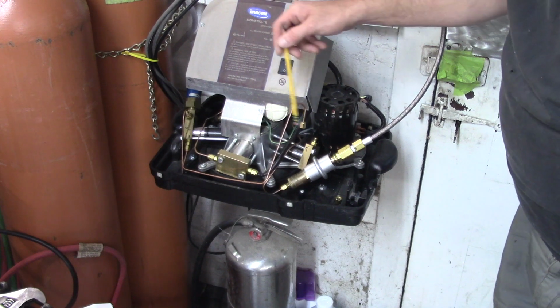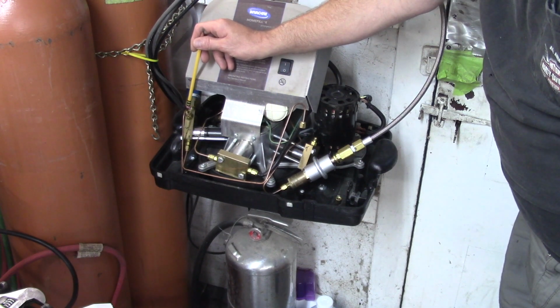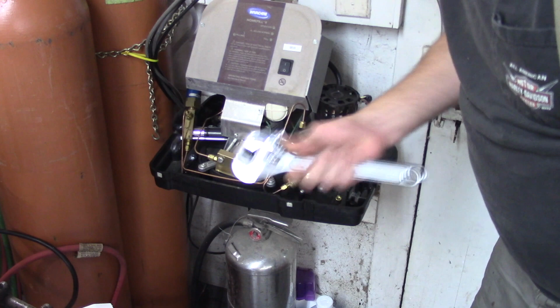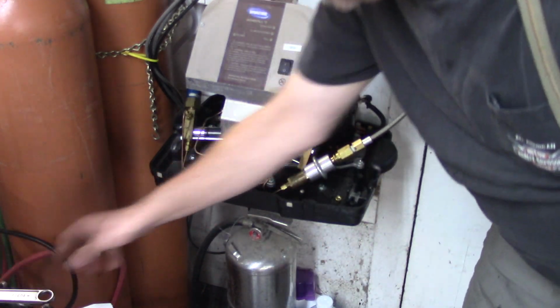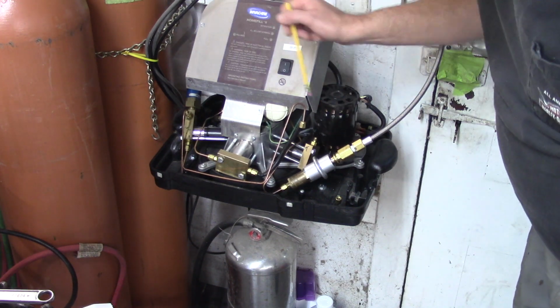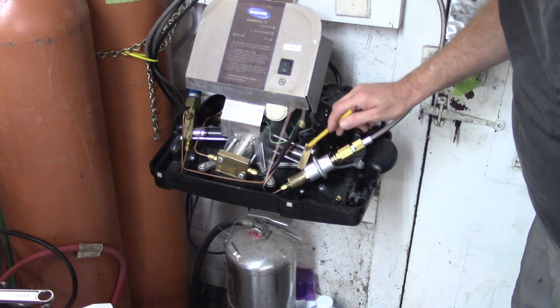So what I did was I used a 7/16 wrench. Actually, because I'm a mechanic, I had line wrenches. I would suggest using a line wrench. Don't use one of these. Use a real wrench. So use a line wrench to disconnect cylinder number 4. Okay, so this is cylinder number 4 out.